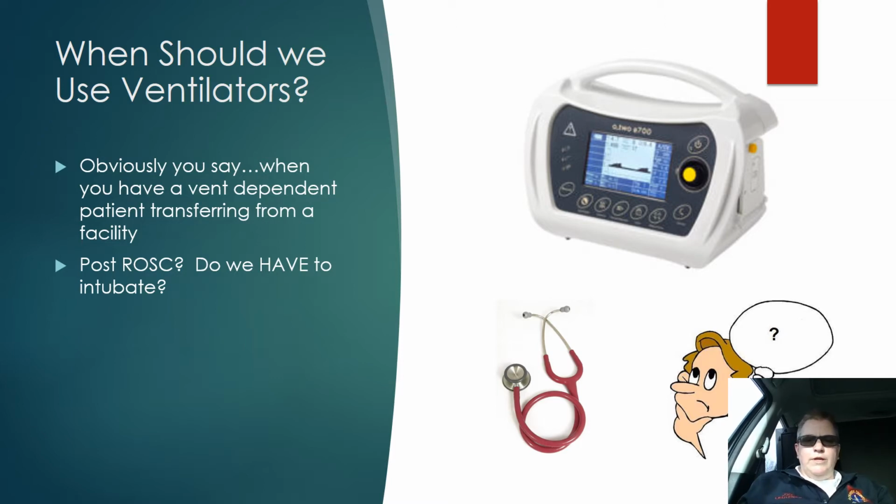So yes, we should be doing that. It's crazy in the back of an ambulance post-ROSC sometimes. So let's do something. Let's free up our hands and let's do better patient care.